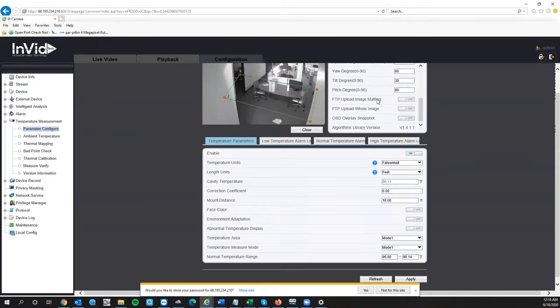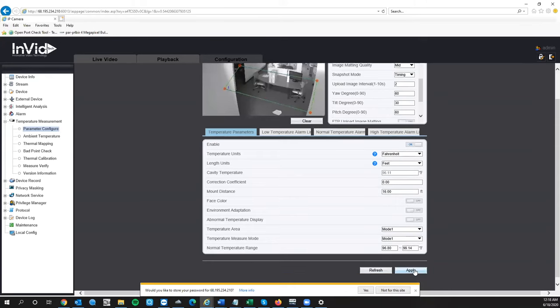One setting I recommend changing: lower your Upload Image Interval. This affects your alarm settings as well as uploading images to the CMS software. We recommend dropping it down to two or three. Make sure any time you make a change, you hit Apply. Your temperature units can be set here — if you switch to Celsius, you'd need to adjust all the numbers you set previously accordingly.